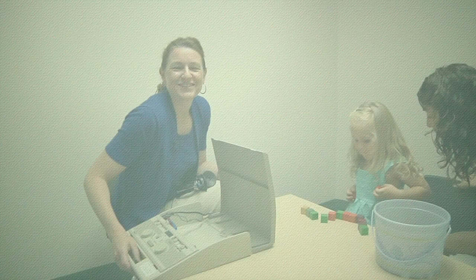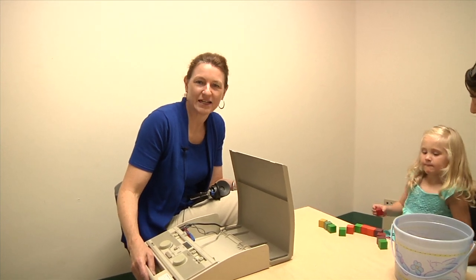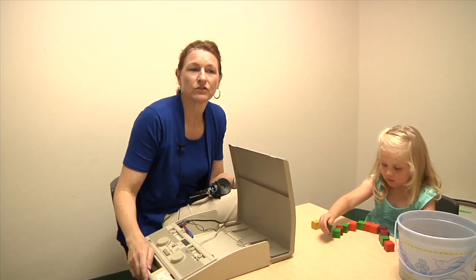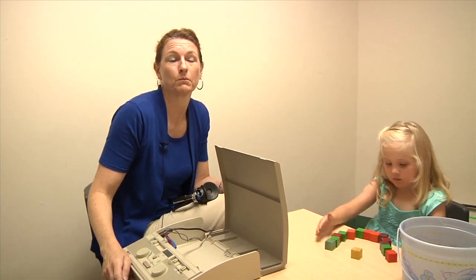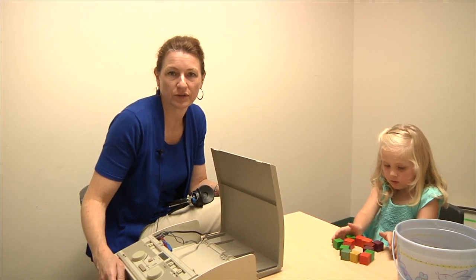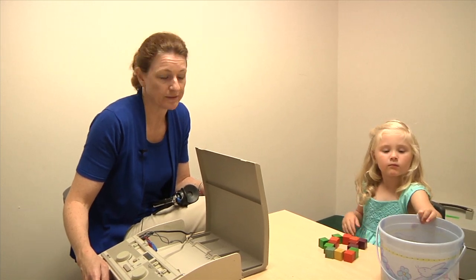Sometimes when you're doing a school hearing screening, you have to test young children or children who are a little bit more difficult to test. And they might not want to raise their hand, or they might have trouble raising their hand. And so instead of a hand raise, you can have them associate some type of game with responding to the beep. Okay, so here are a few examples, and I'll start off with very simple: dropping blocks into a bucket.